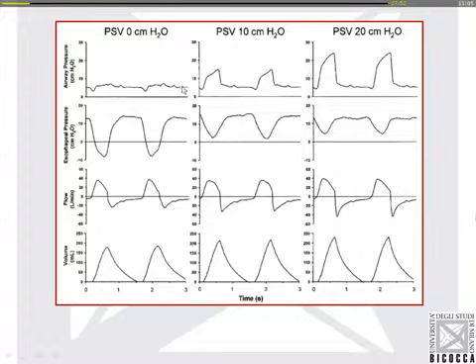We do know that our patient has a given target in his mind. He or she likely wants to control the PCO2 and have it at a given level. So basically, the patient would like to have the minute ventilation be constant. And we are able, with assisted ventilatory modes, to share the work of breathing which is necessary to achieve this minute ventilation in a variable way between the patient and the ventilator.